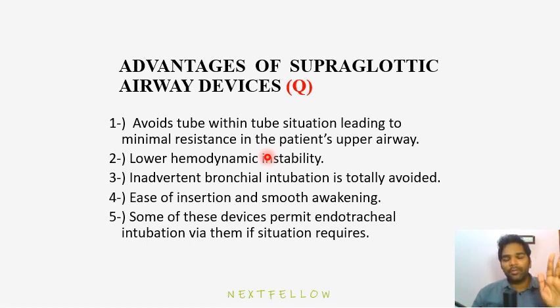Normally, airway resistance will be lower because you are not entering the glottis. And lower hemodynamic stress. Normally intubation will cause hypertension and tachycardia, sometimes even bradycardia and arrest. So those responses can be avoided.